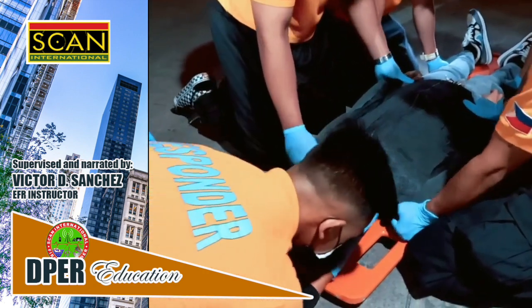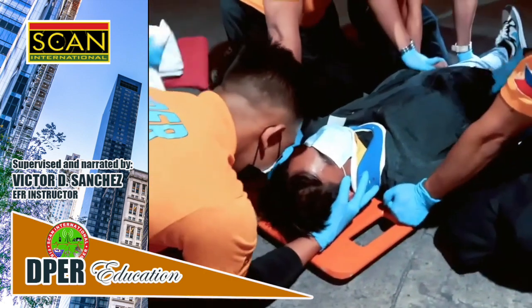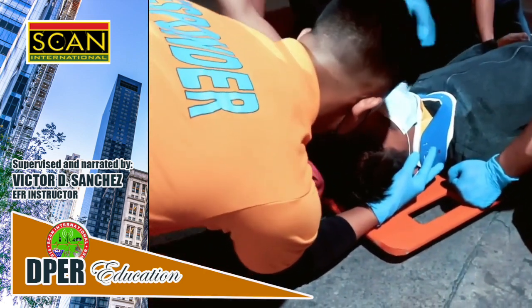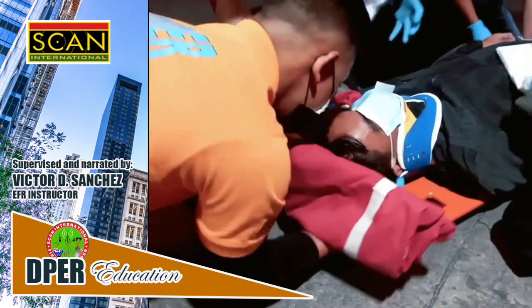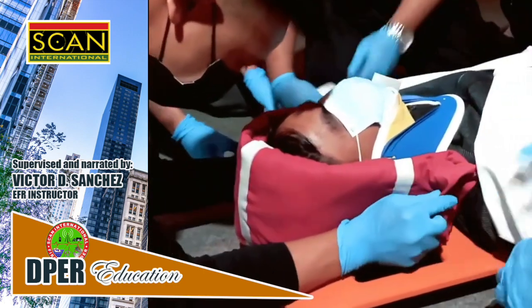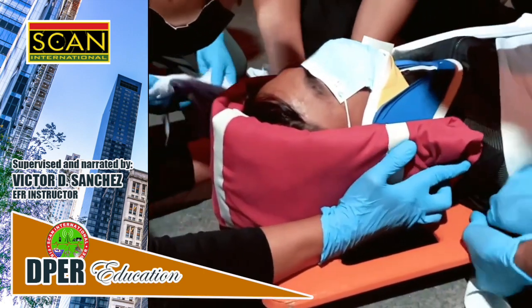Apply head stabilizer. If not available, you may use other items to prevent movement of the patient's head — for example, jackets, shirts, blankets, shoes, or pillows. Fully secure the head and body with straps or bandages.